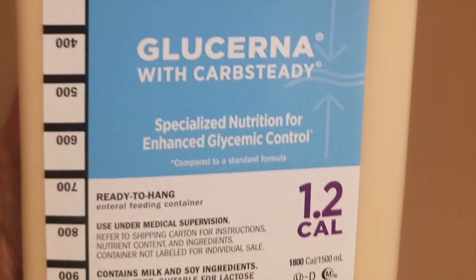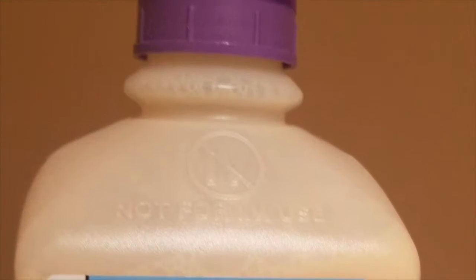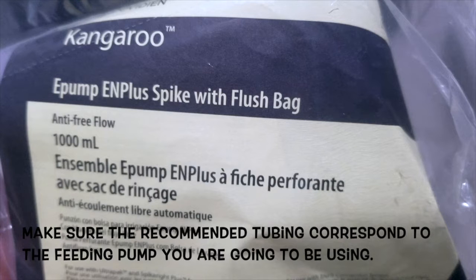So this is what the formula bottle looks like. They are usually customized to the patient's dietary needs. Depending on your facility and what manufacturer they use, just make sure the recommended tubing corresponds to the feeding pump you are going to be using.